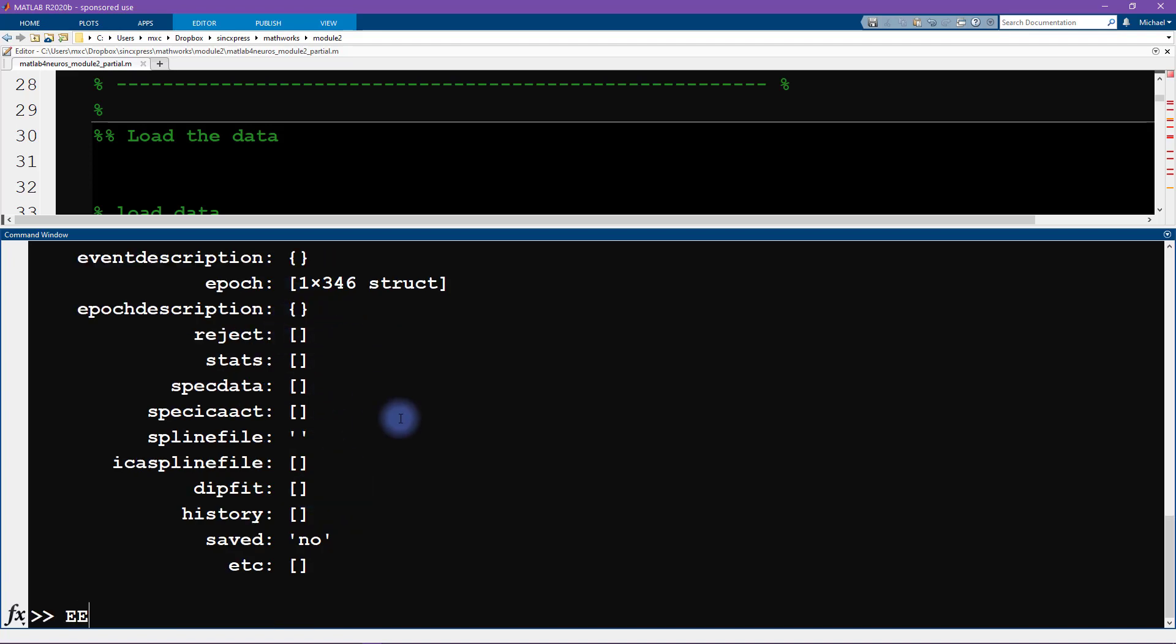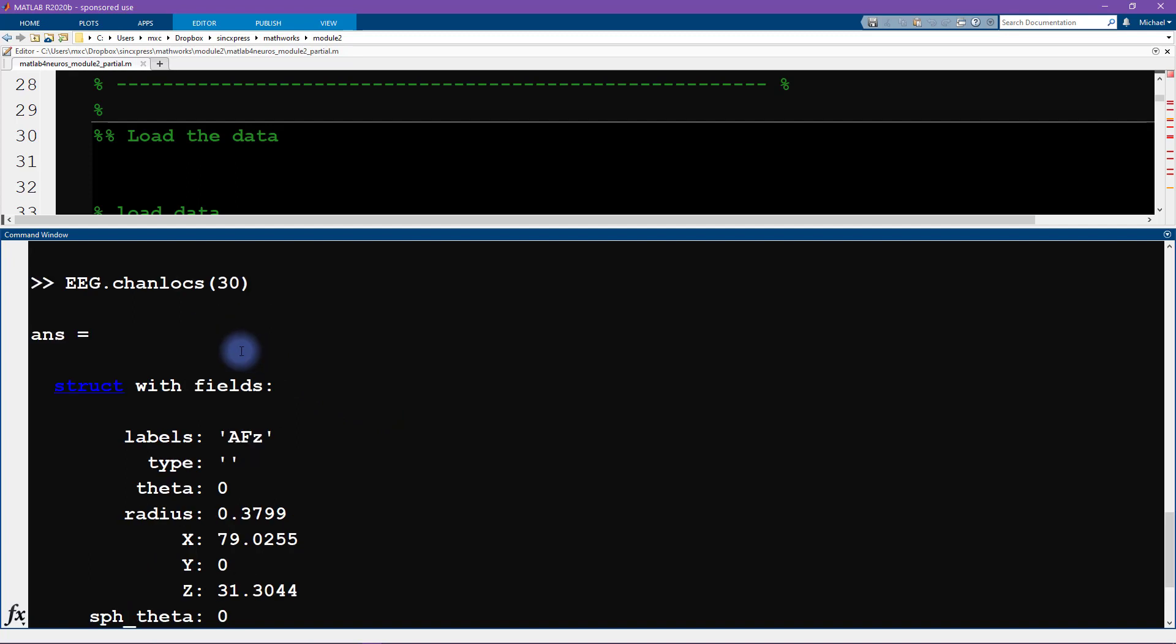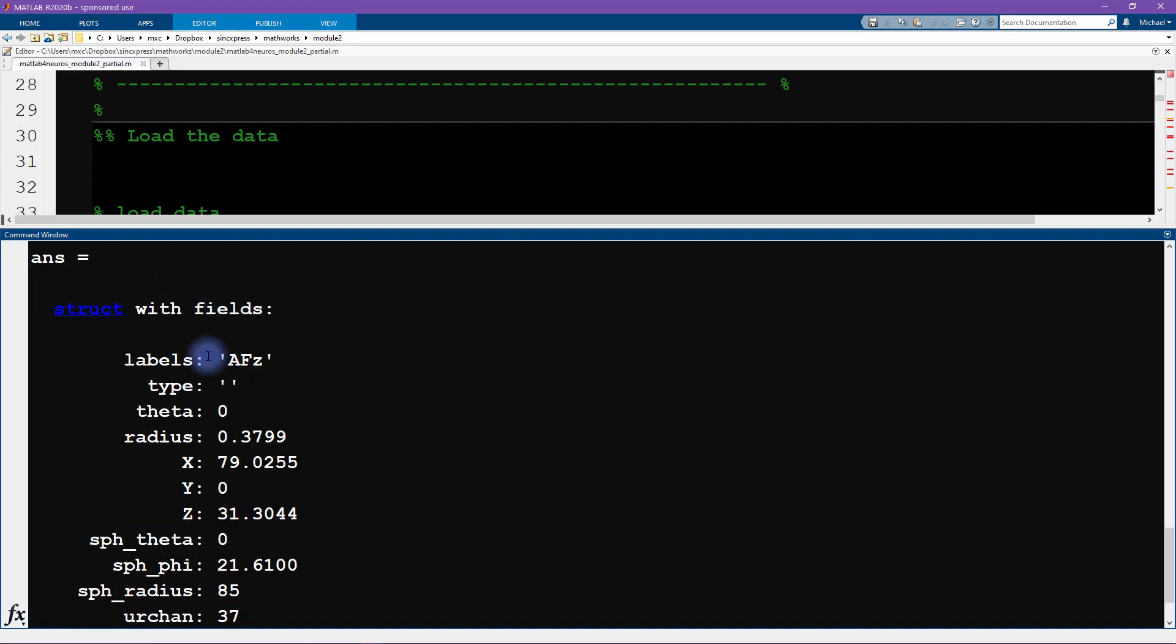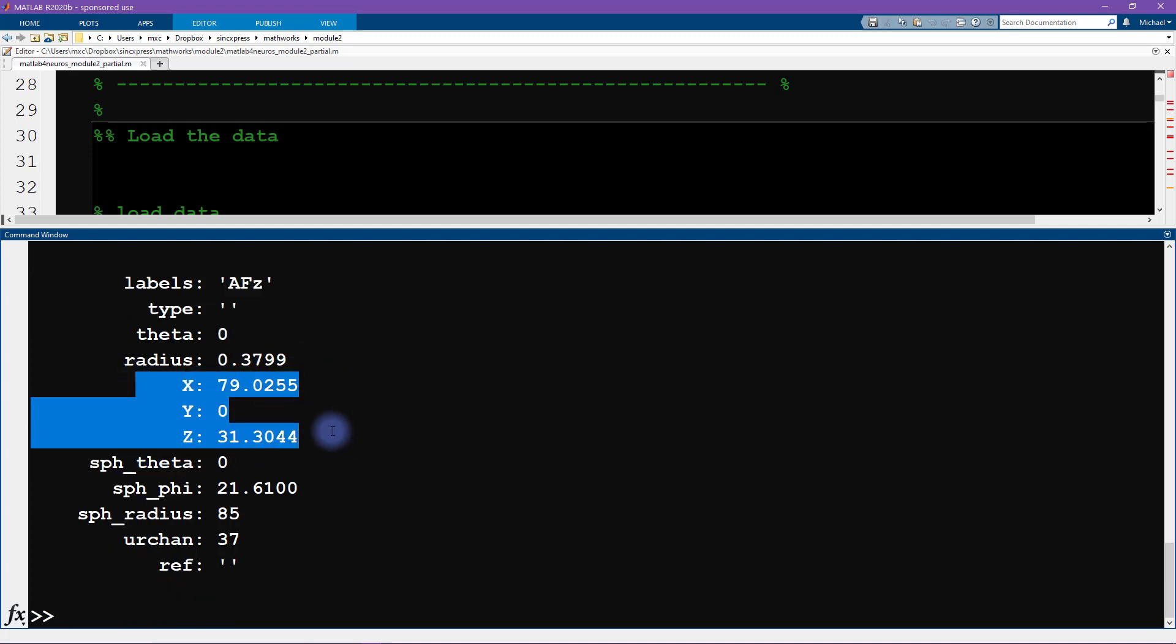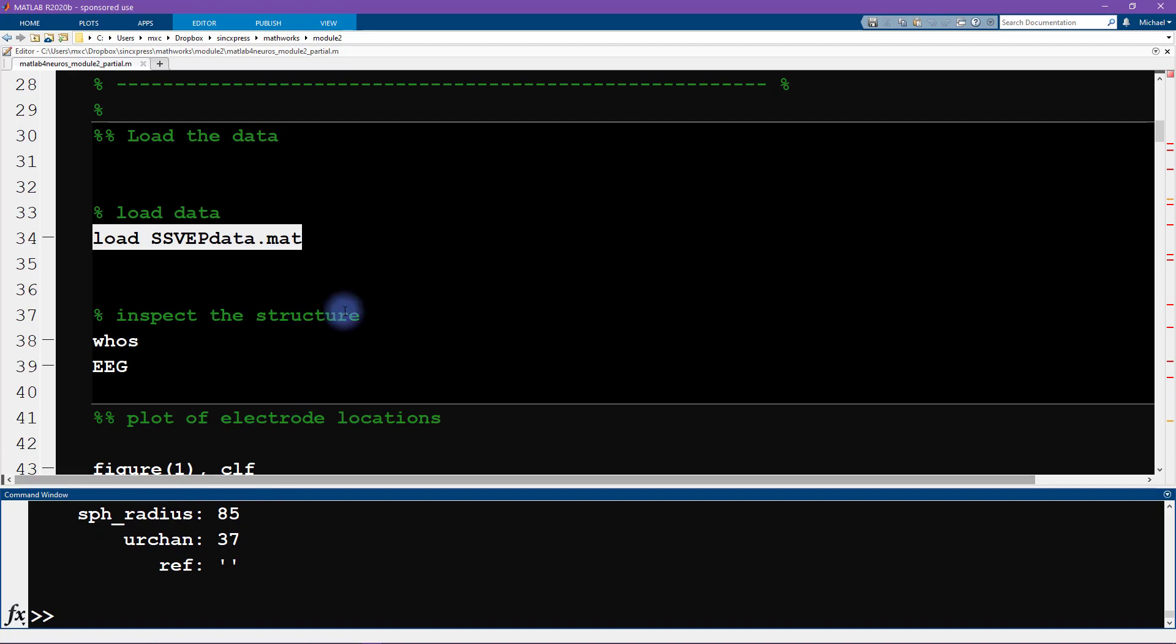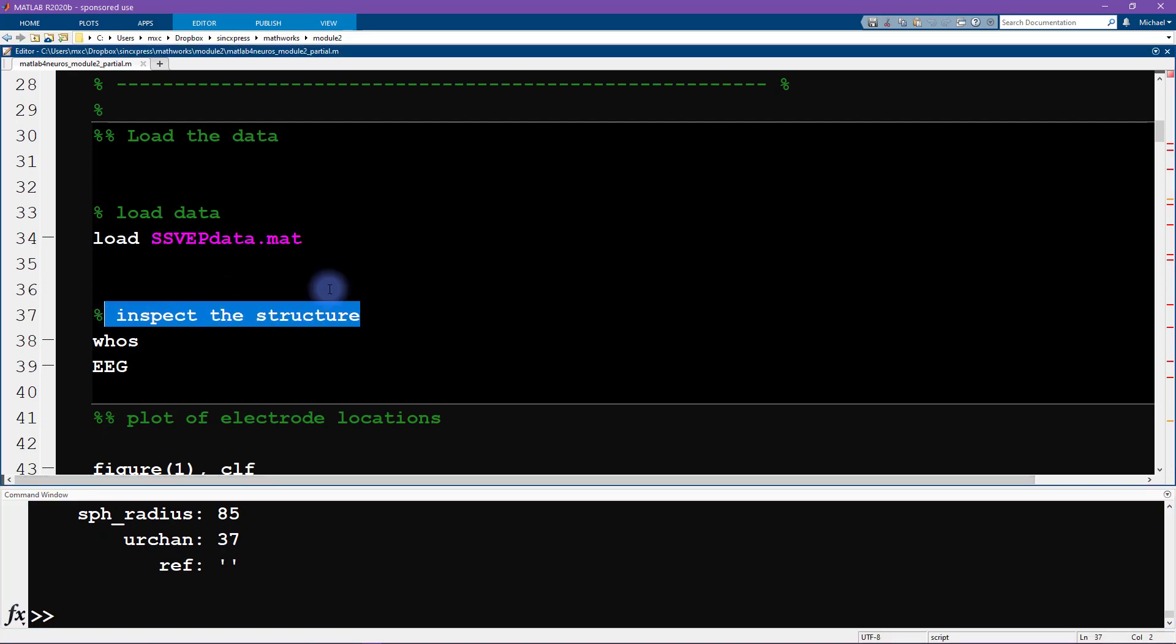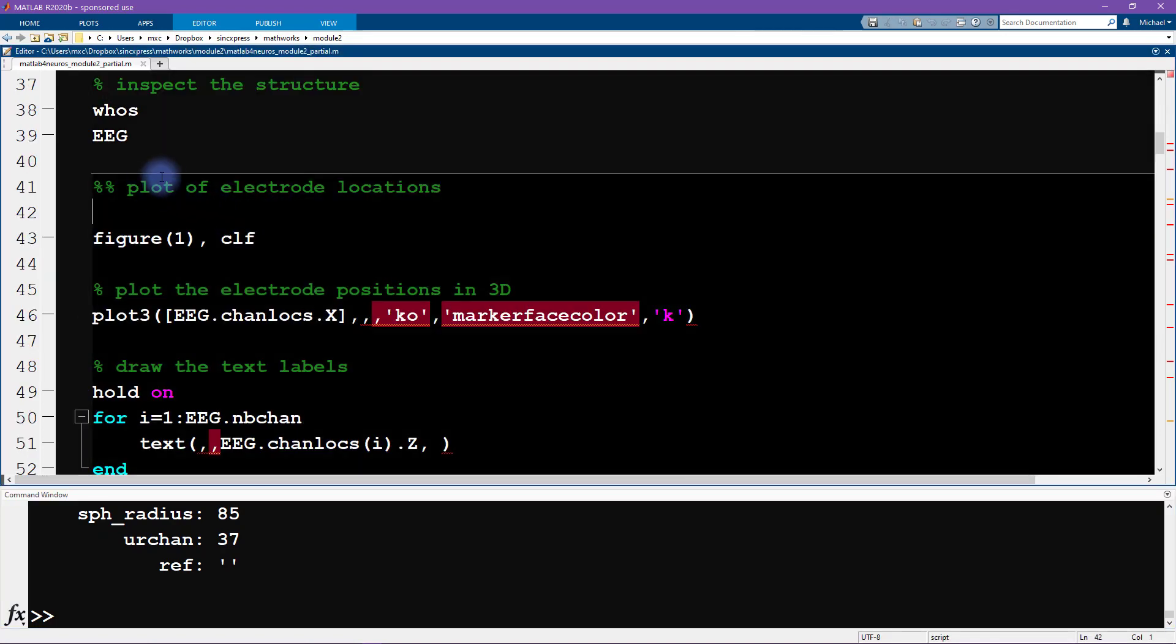We can have a look at this EEG.chanlocs and let's have a look at electrode number 30. So we can see that this is electrode number 30, it's the 30th channel index. Here is the label. We're also going to be using this information. These are the XYZ coordinates of the electrode on the scalp. So with that as an introduction to the data structure, let's start plotting.